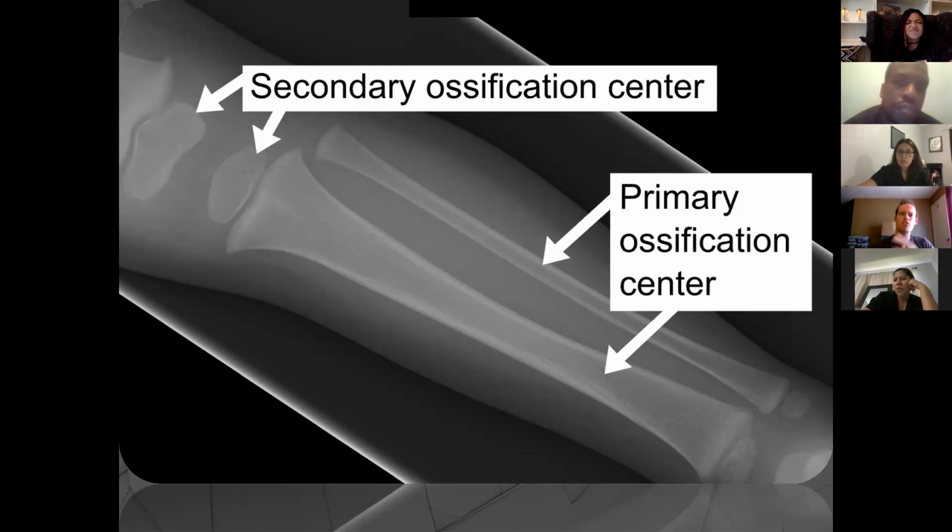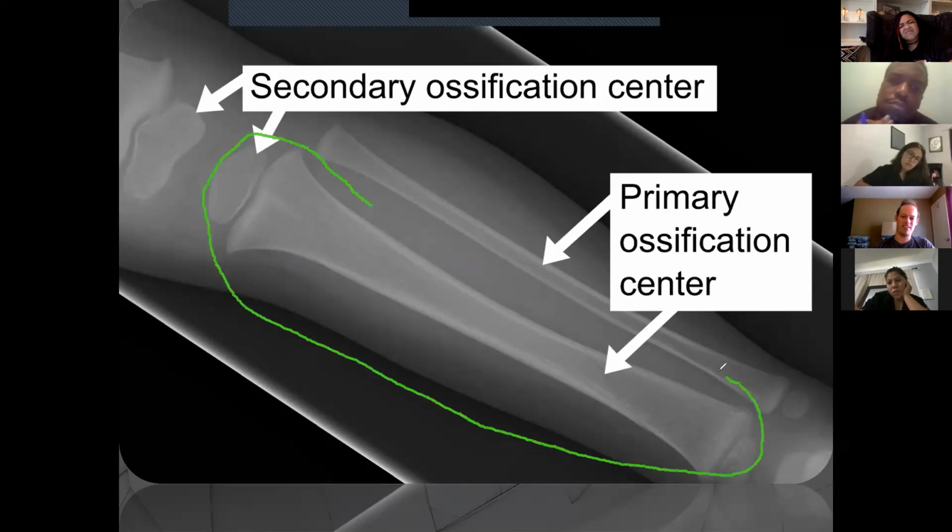Good observation, but that's normal. That's supposed to be there. There's no markers. I wasn't going to mention that, but yes, you are correct, Tracy. There isn't a marker on there. Very good. So I wouldn't want to pass that either. But there's still something peculiar on the tibia specifically. Let me circle the tibia in case we don't know what the tibia is, guys. This is the tibia. There's something peculiar on this bone.